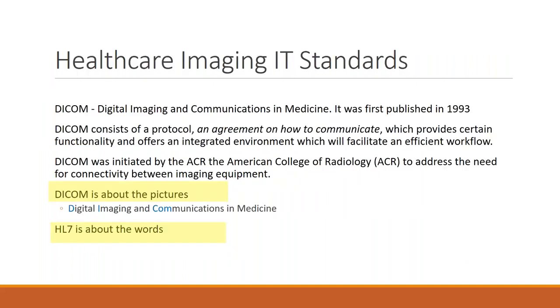This is one of the most important slides we cover because these are two very distinct items within the IT world that will help you in a meeting, because if you speak out on the wrong side of this, you sort of lose some credibility as to understanding what's happening. So DICOM is the Digital Imaging and Communications in Medicine. It was first published in 1993, so it goes way back.